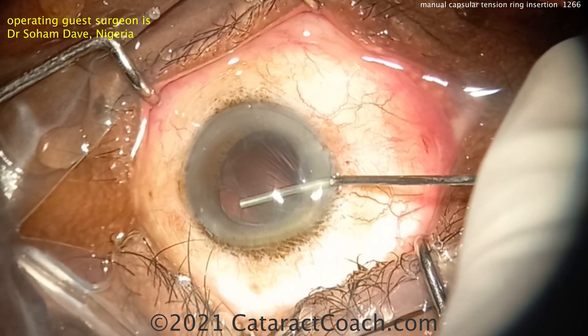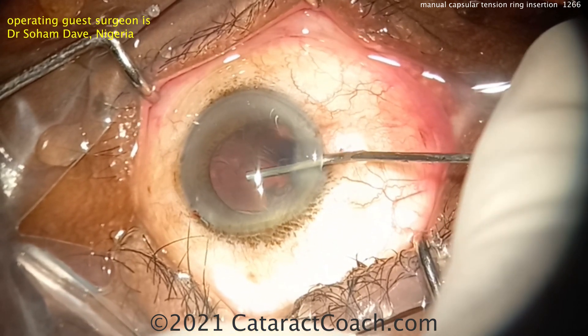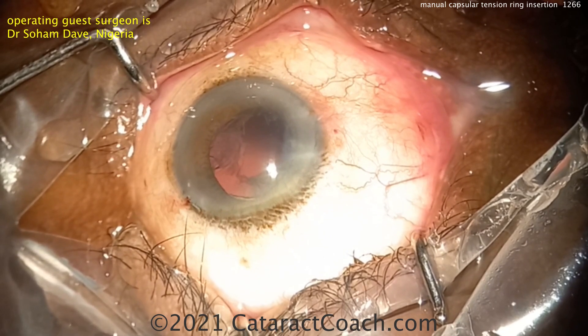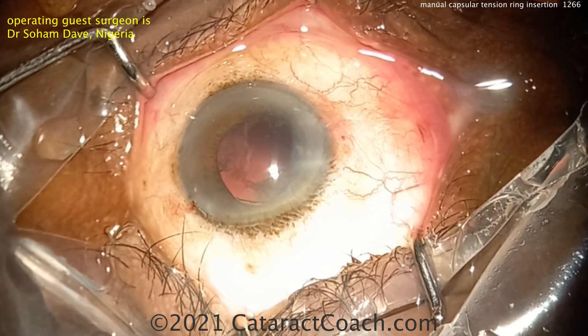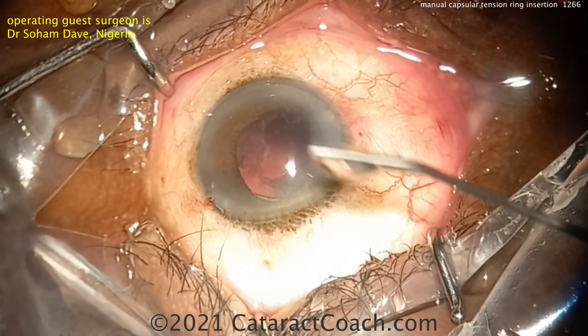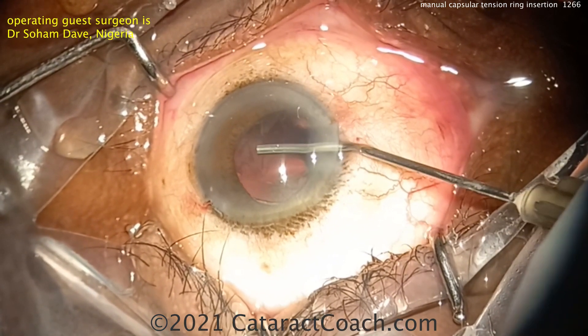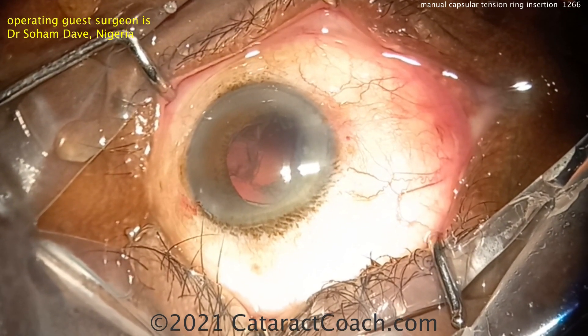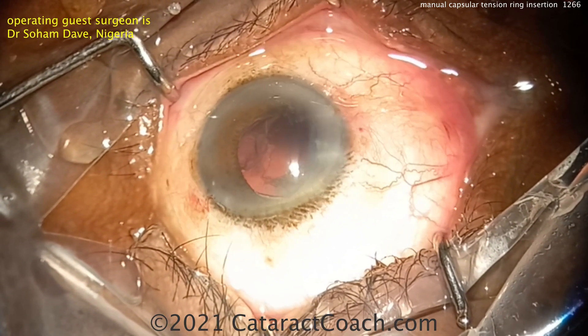Looks good. Putting some viscoelastic in here — maybe a little bit of cortex, maybe a little weakness in the capsular bag. That's why the extra step of putting in viscoelastic is a good move. This patient may have a history of recent trauma. More viscoelastic going in — always a good idea, taking a lay of the land, seeing what's going on.